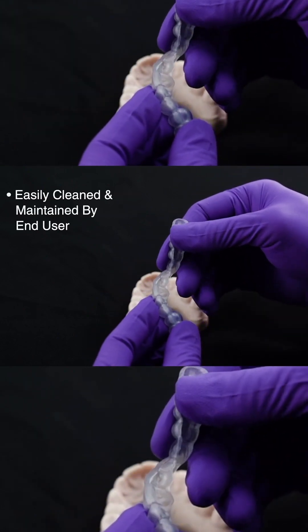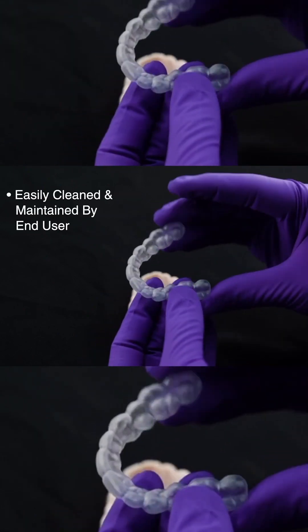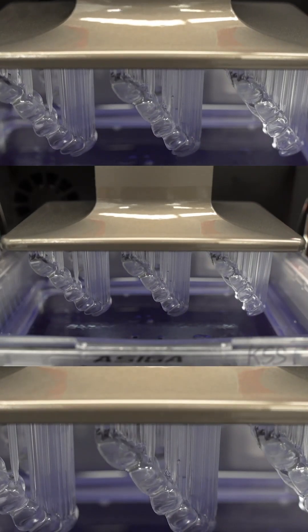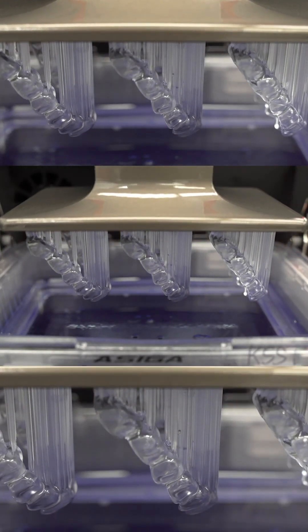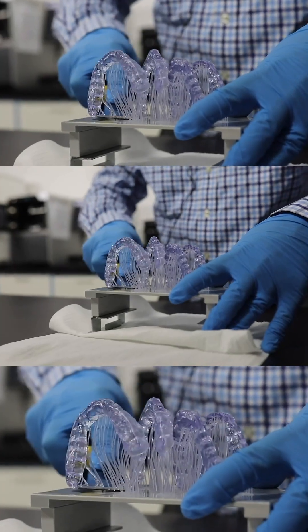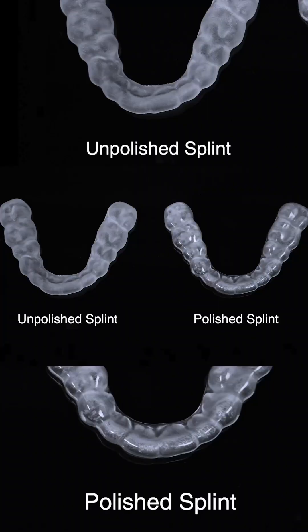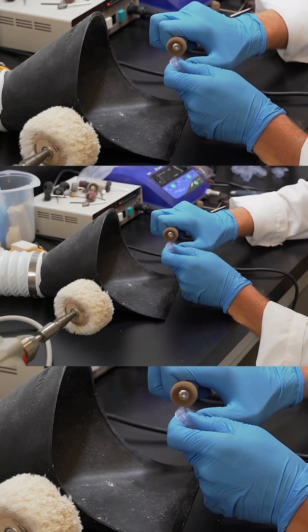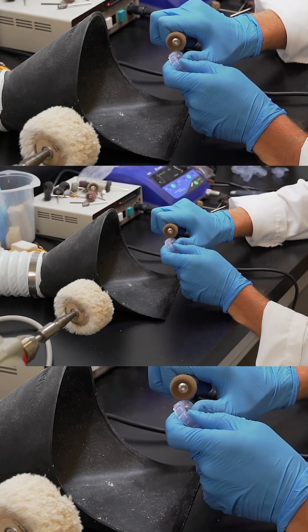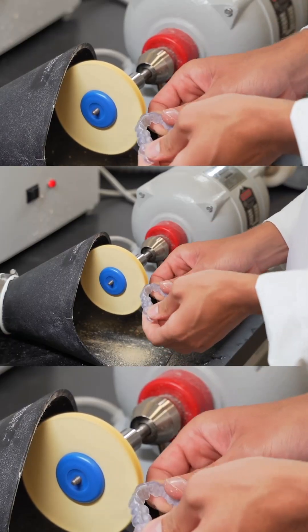It is also easily cleaned and maintained by the end user. KeySplintSoft is made in the U.S.A. and has three years of guaranteed shelf life. The formula has long-term color stability with a translucent and aesthetic appearance. It offers a highly efficient and streamlined way to manufacture splints and nightguards with significantly reduced labor and material costs.